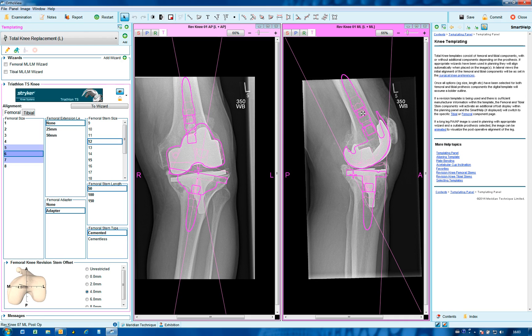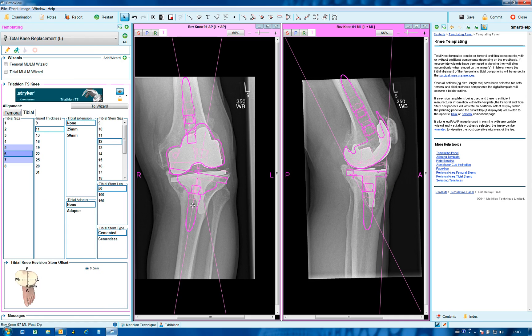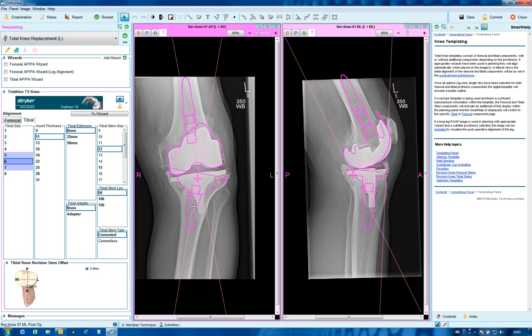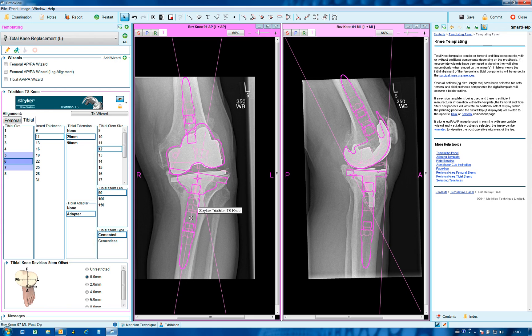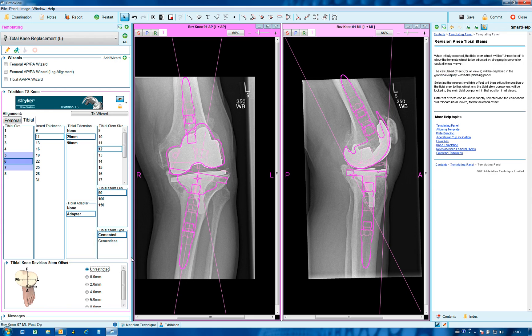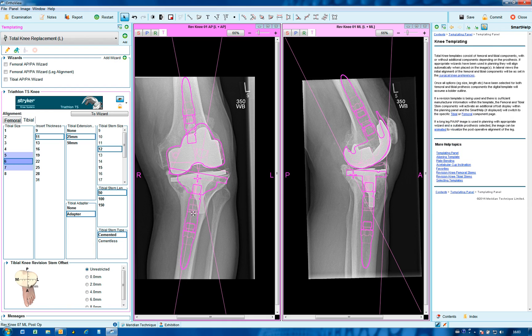The vector diagram represents the combined outcome of the two views. Moving to the tibial component, selecting and adjusting only happens if the adapter is selected. Tibial extension can be modified if needed and adjusted just as previously by choosing the unrestricted mode and moving the stem to suit.